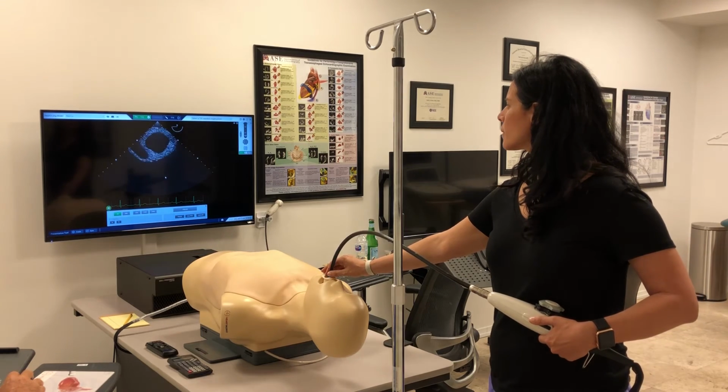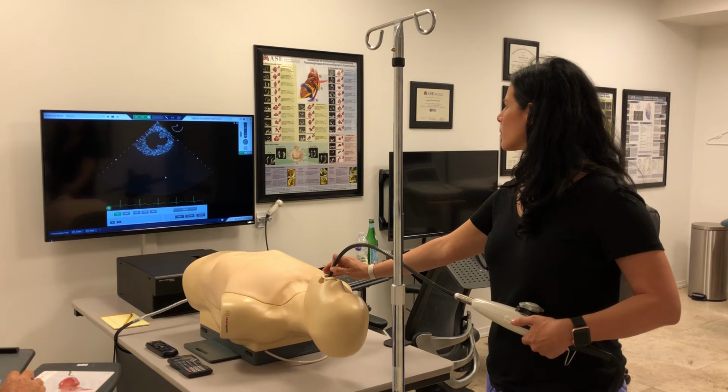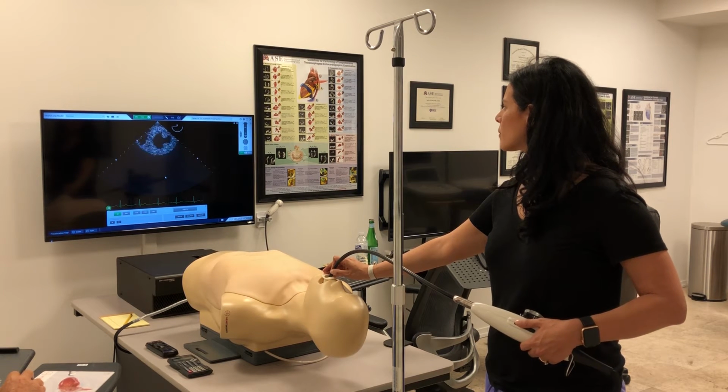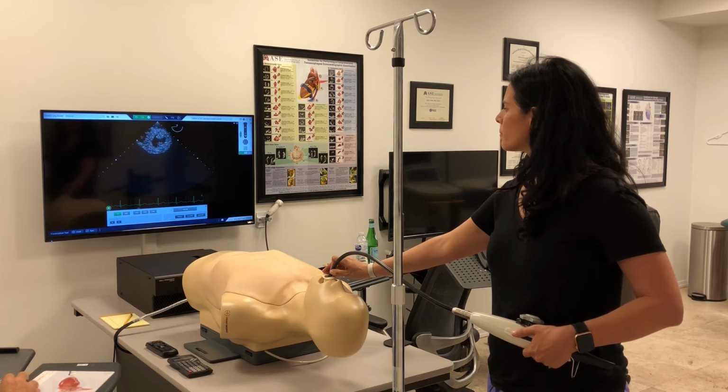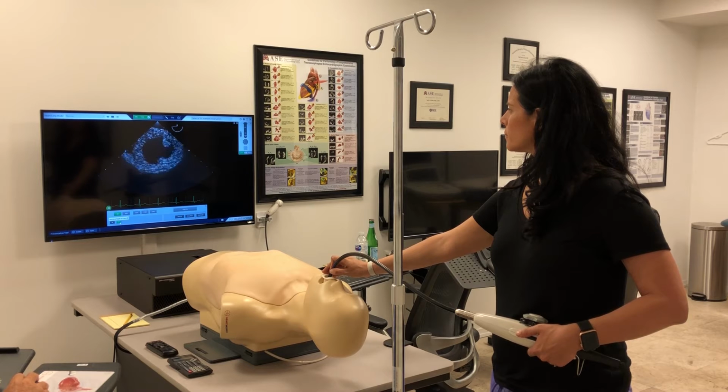And I like to go to the home view of the stomach, or what I call the home view of the stomach, which is the mid short axis view. So the full name of this view is the transgastric mid, because it's at the level of the papillary muscle, short axis view. Let me just change the depth of the field to be more appropriate for the image size. Good.